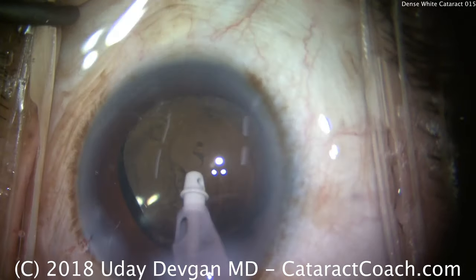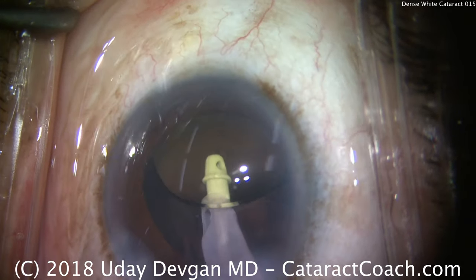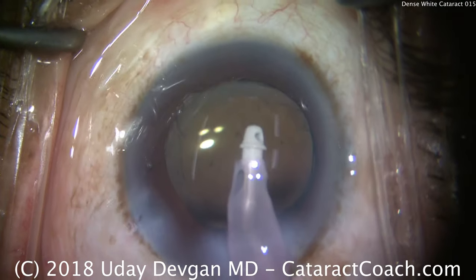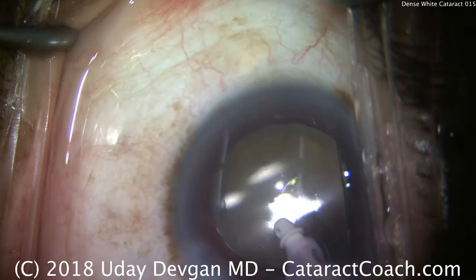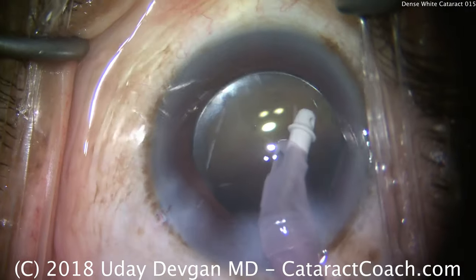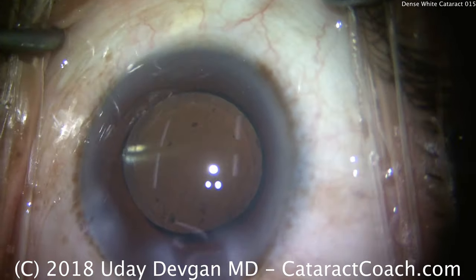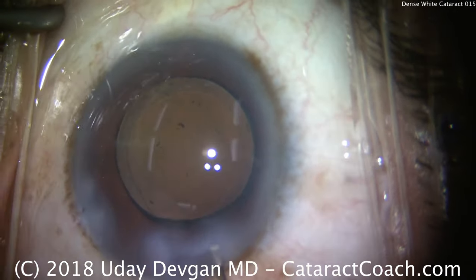And the IA probe to remove viscoelastic — I like to go behind the IOL as well to remove viscoelastic there. Important on the cortex removal: you have a more conservative setting, and on the viscoelastic removal, a much higher flow. I want fluid to flow through here and wash out any viscoelastic, any cataract pieces. We see the rhexis overlapping the optic very nicely — that looks great. Cleaning out the rest of the anterior segment. So this is an interesting case — a white cataract on the yellowish-brownish side of the spectrum, so we did not get any milk or lens fluid coming from the lens capsule.